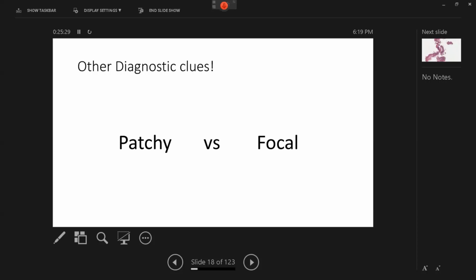Right, so I agree with you that patchy will have some skipping, but doesn't focal also have skipping? It does. But if you are to use the word focal, use it on the single biopsy. So if you are describing for me one cecal biopsy and it has one focus of inflammation within it, then just describe it on that single fragment.